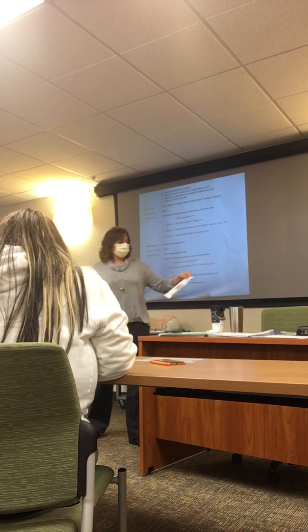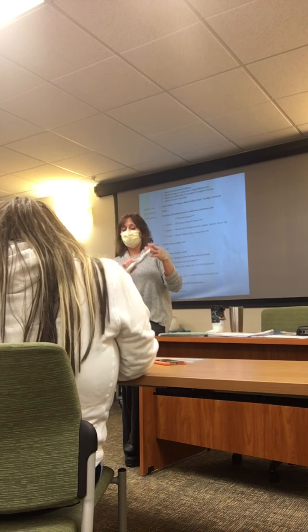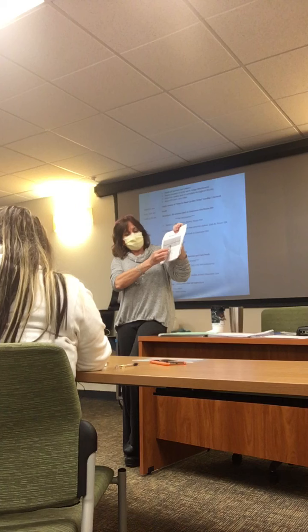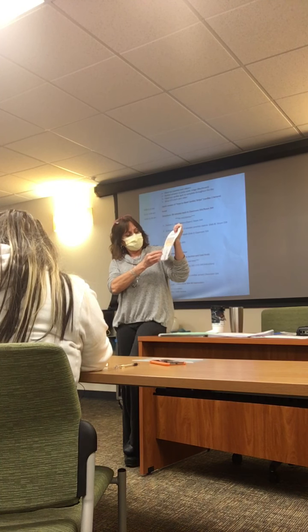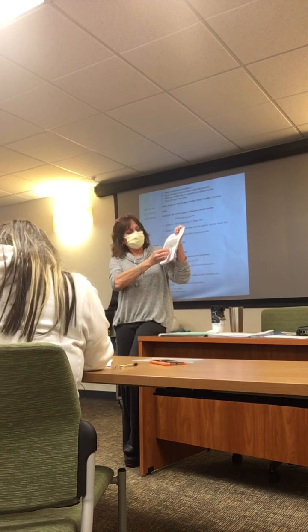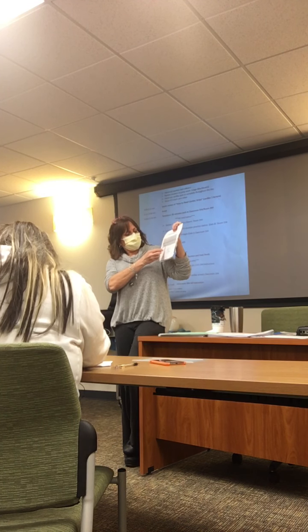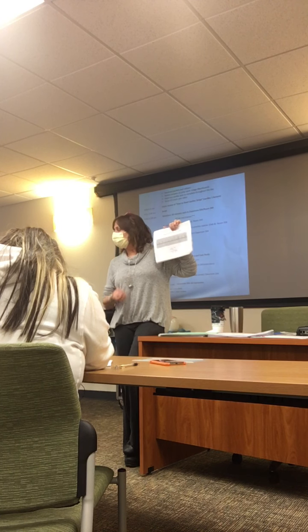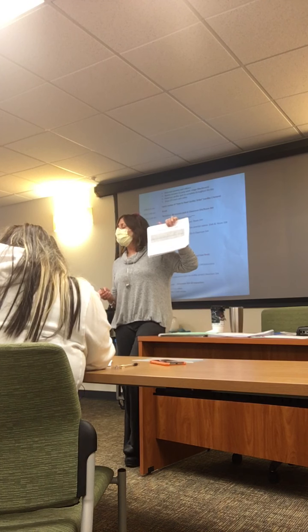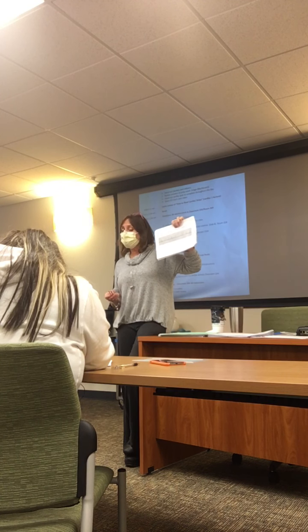So if I look at this first strip and going along with how to read all these strips, the first thing I want to do is look at the P and the QRSs. So the P waves are the smaller upward deflections before the big QRS complexes. So I'm looking, is there a P wave before every one of the QRS complexes? And then I'm looking at the QRS complexes. Do they all look about the same? Is there one P wave for every QRS complex? Yep. All right, so then I'm going to measure the PR interval.